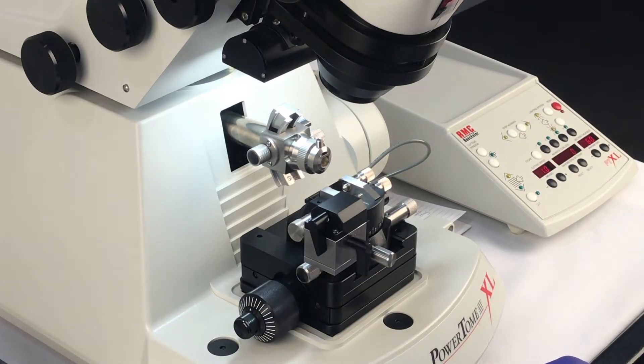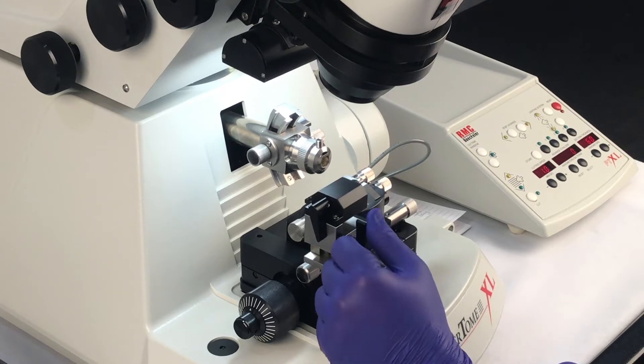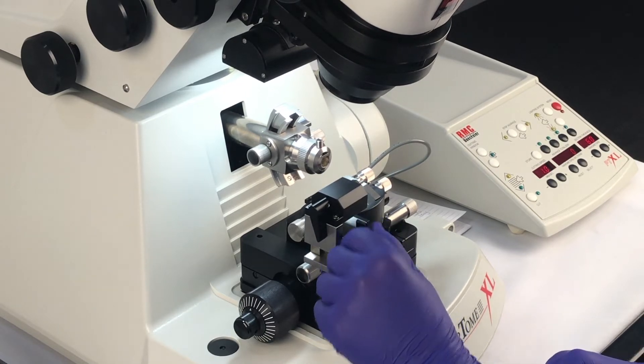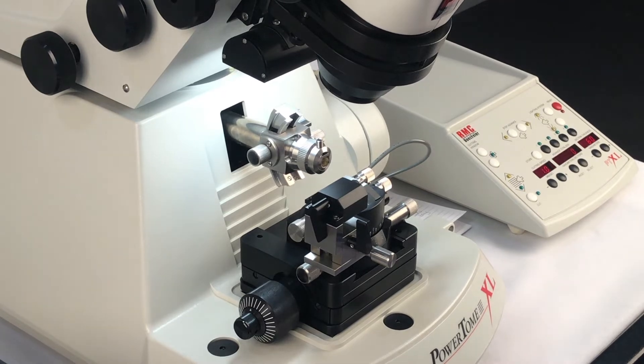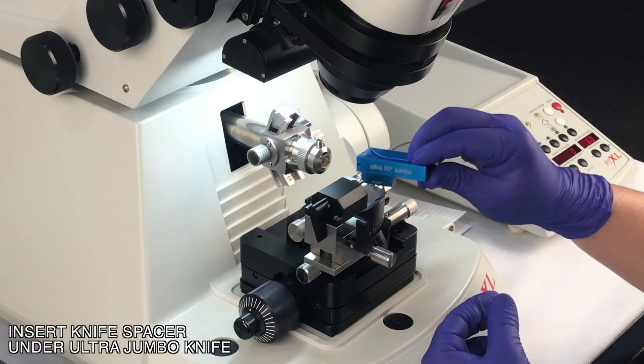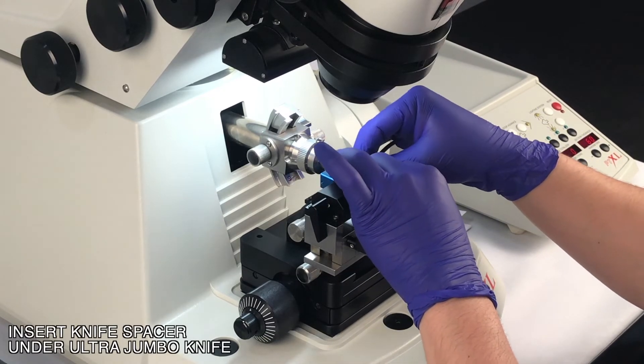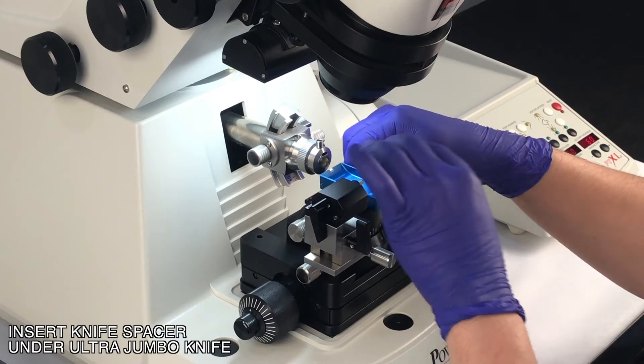To make it easier to install the knife, we're going to raise the vertical on the Ash 2. Now we grab the Jumbo knife and we'll install it and secure it with the thumb screw on the right side.